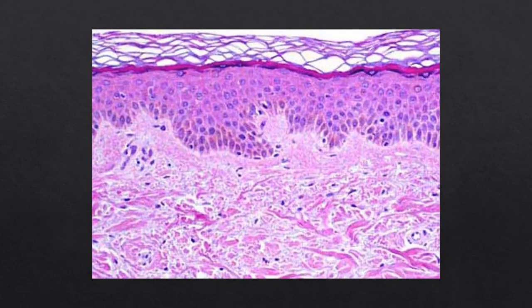Let us analyze this tissue sample that was stained. The staining procedure used on this tissue sample is actually an extremely common stain called the hematoxylin and eosin stain. The staining is so standard that it is even referred to as the gold standard of histology. Looking closely at the slide, we can actually tell why staining is so essential.